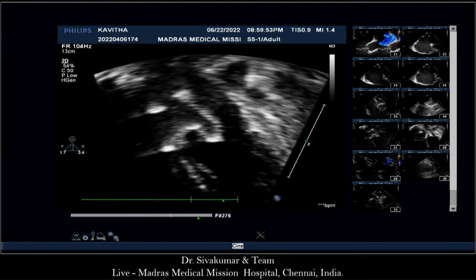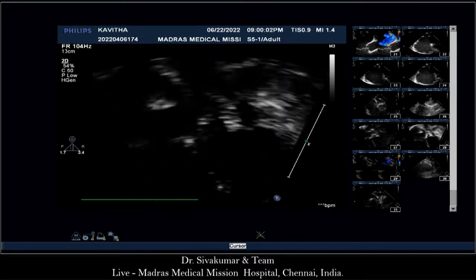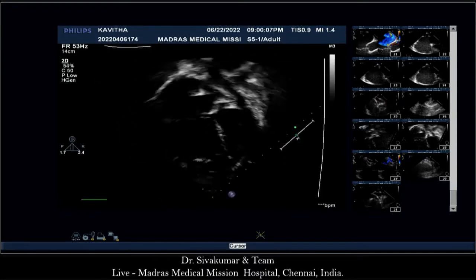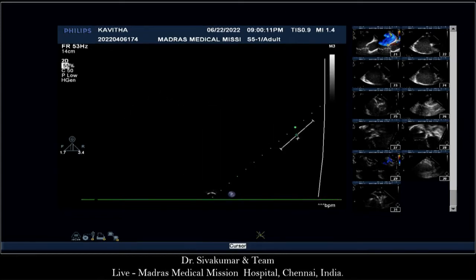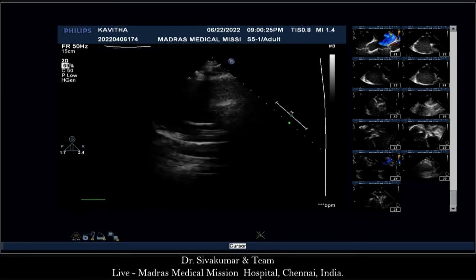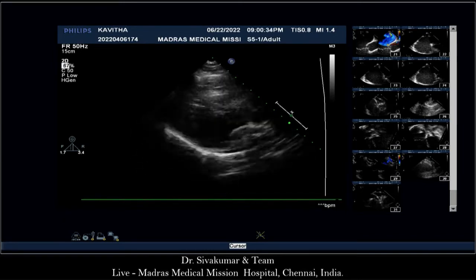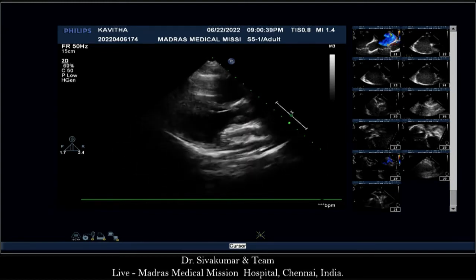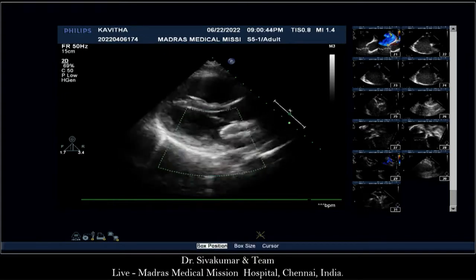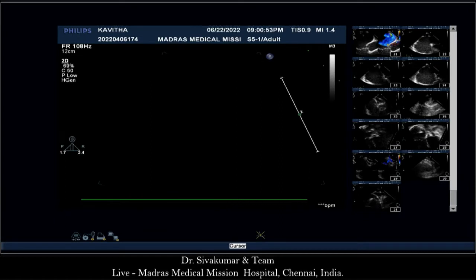Okay. It looks good. Shiva, you decide what you think is right here. I mean, as Iqbal was saying, to me, it's the mitral valve leaflet, and that's the edge of the disc. Do you have any experience of the touching device on the anterior mitral leaflet causing mitral valve erosion? We have not heard of and have not had such an experience. Not reported, but in case series they reported mitral valve erosion, though they didn't describe it in detail. It has been described with a cribriform device in India once, because the cribriform device edges are a little sharper.